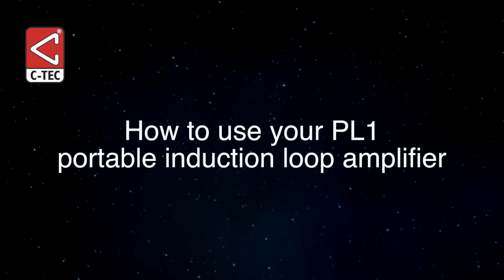How to use your PL1 amplifier. Position the fully charged amplifier so its front is angled towards the hearing aid user and its back is facing you. If the hearing aid user is in a wheelchair, take care not to block their view.